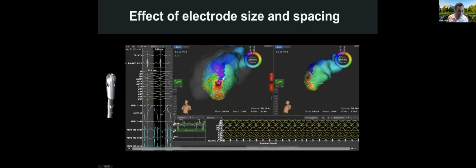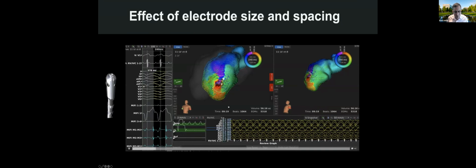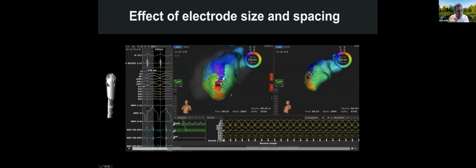I like to show this example because it illustrates the point of small electrodes for mapping areas of heterogeneous scar. This catheter is actually an 8mm catheter that has microelectrodes on it, called the MiFi catheter. Now in this case, we mapped already. It's a fast VT, but we were able to map fairly quickly, like the VT with the Orion catheter. This is the VT, and now we put the MiFi catheter just about to ablate. And I want to show you.